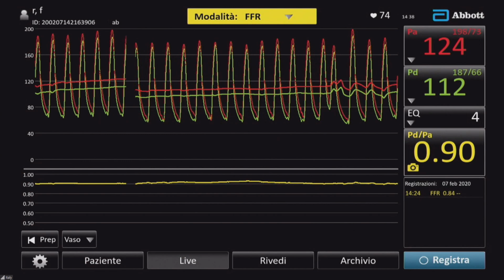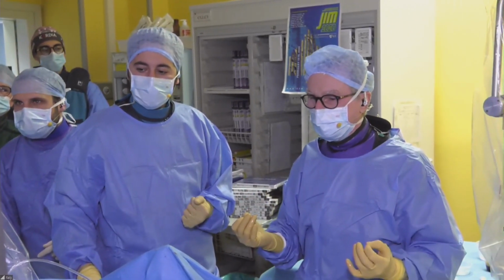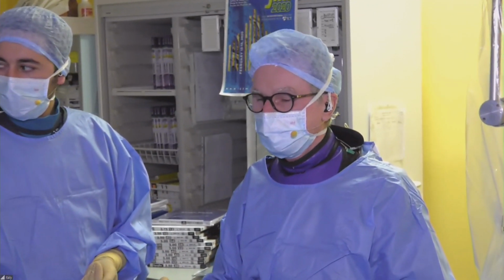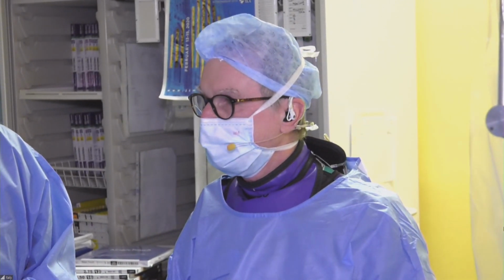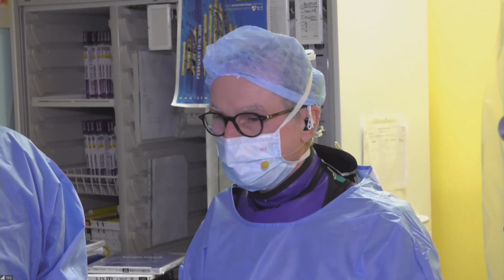Okay, don't you think this is the way PCI should be done? You'll be surprised, just a little bit before your case, we had a lengthy discussion on this and the results of defined PCI and how we should go with precision PCI in the future.